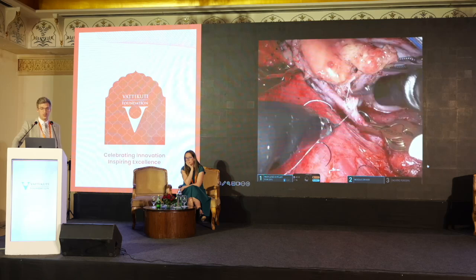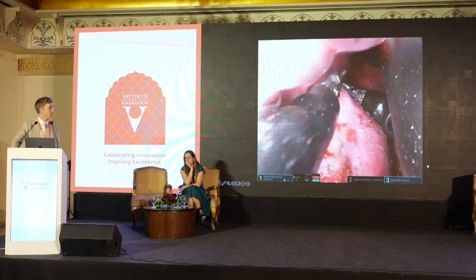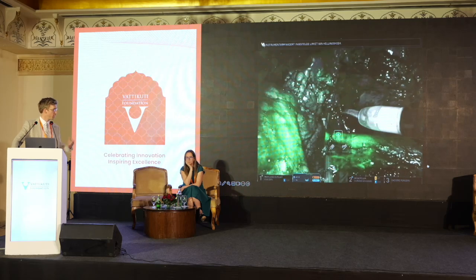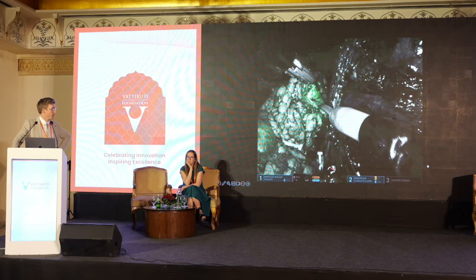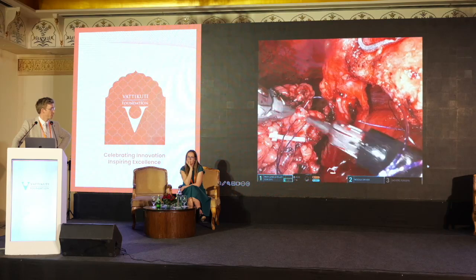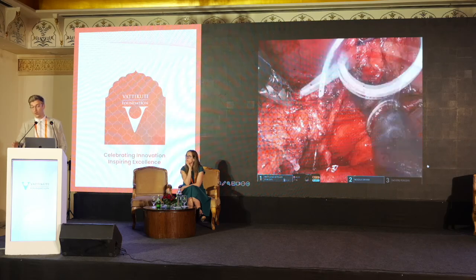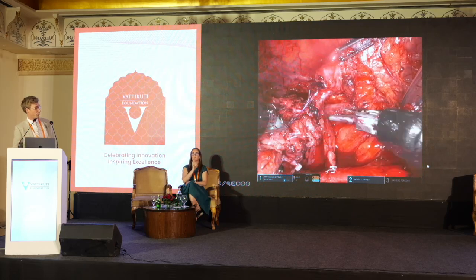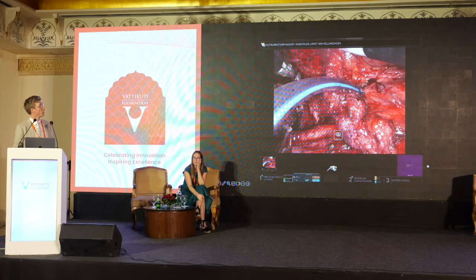So we finish the anastomosis, and we do the ICG, and with the ICG you see that the turgor, the flexibility of the kidney, is very normal in this case, and we see that the kidney is being perfused very well by the single artery, as well as the ureteral stump, which was also very nicely perfused. And then we use a Quill 4/0 suture to finalize the ureteral anastomosis on the native ureter, so we don't have to do a bladder anastomosis.